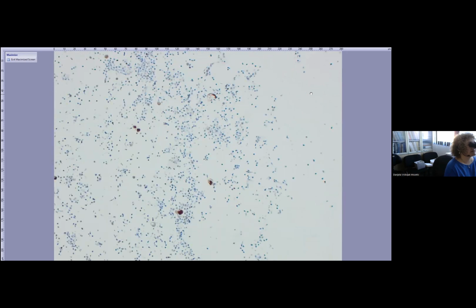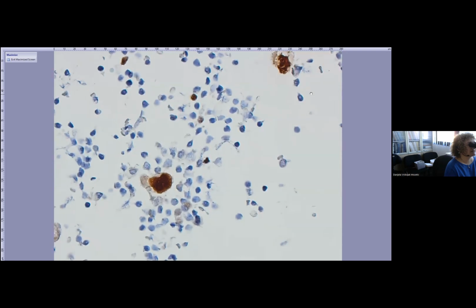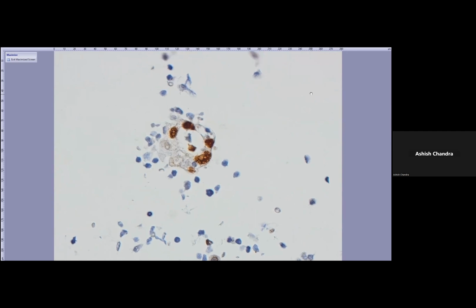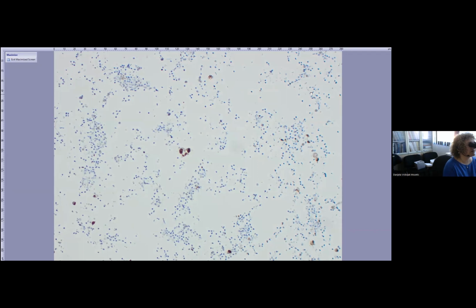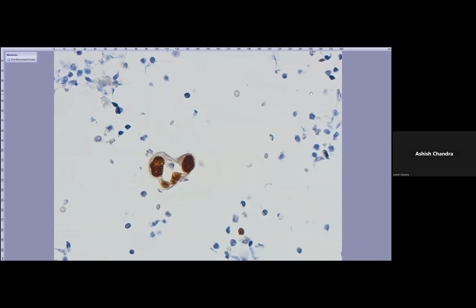And it is nuclear staining. So this is positive. And is this also superimposed on the PAP stained slide, Danijela? Because you said that you do your immunostains on the PAP stained slide. Sometimes on PAP stains, but if we use cell block, we don't use. Oh right, we don't duplicate. Yeah, this is cell block. Of course, we don't duplicate. But this is all on cell block. Got it. You can see it here.